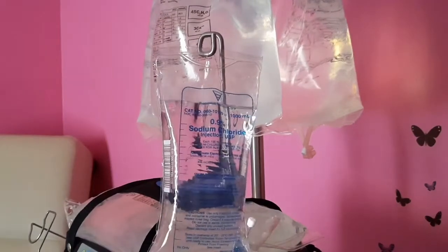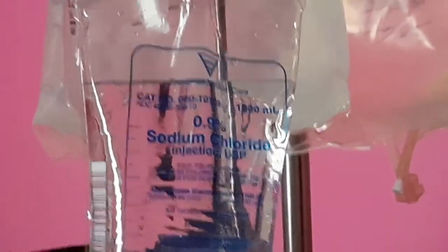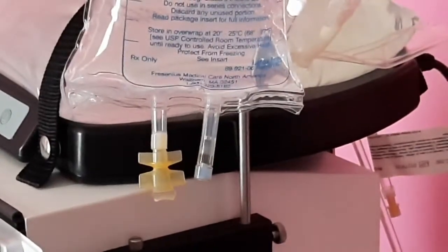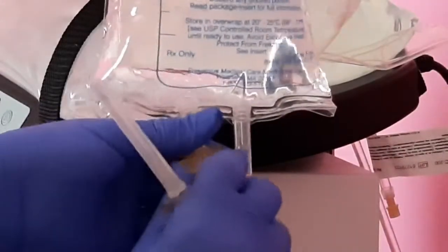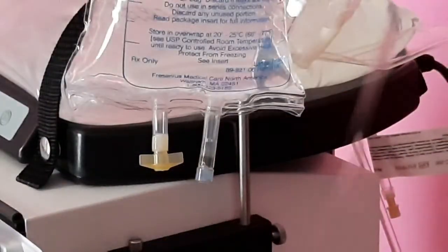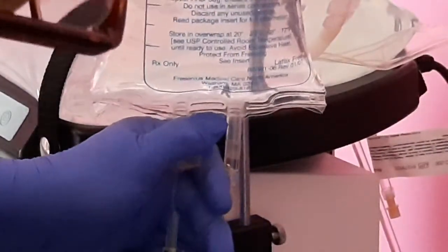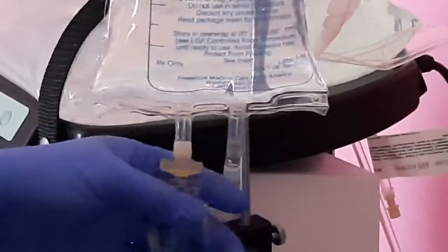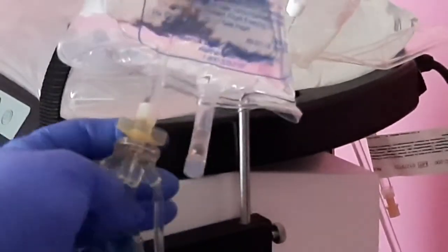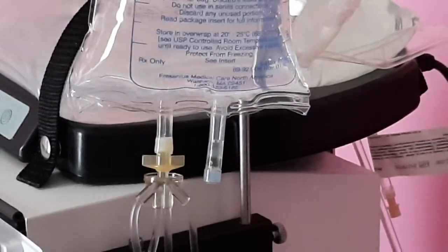Alright, so here are the two wings. Let me do a little close-up on that. There are the two wings right there. So we're going to hold the top wing as we twist off the bottom wing. We're going to then remove the cap off the sterilized spike. And we're going to push the spike in and twist and turn all the way, left and right, all the way up until you get a nice tight seal. You see that? That's what you want. And try not to poke the bag. It's easy to do. Alright, so now we're done with that part.